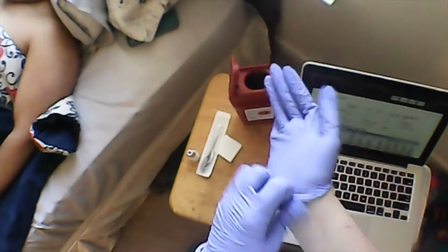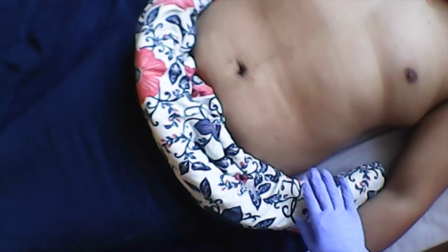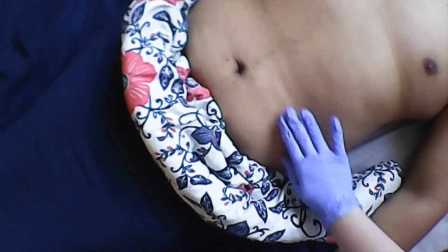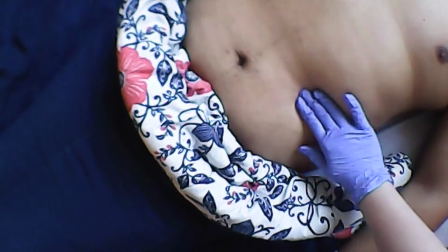I just want to inspect the injection site so I can make sure this is a proper injection site. It is going to be given in your abdomen, okay? Okay. Can I move down the blanket? Might be a little chilly. So I want to avoid the area 2 inches around the umbilicus and the belt line. So I'm going to look in this area over here. I see no redness. Does it hurt when I palpate like this? No. Okay, perfect. All right, this looks like it's going to be a good area.